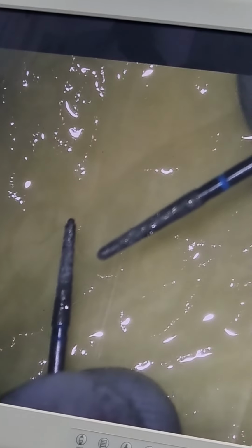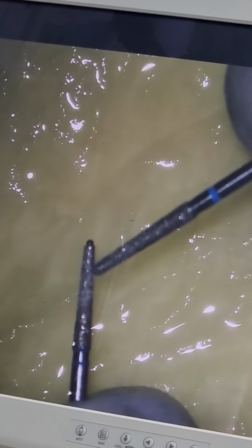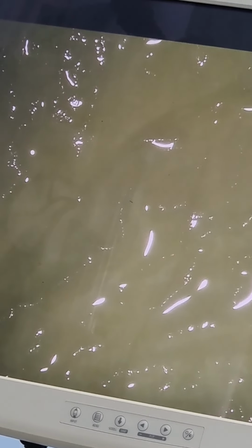Considering the size, if you use the burr on the right, obviously there will be more removal of the tooth structure. Chances of gouging or over preparation or overcutting are more. So I will use this Endo Z burr. The selection of the burr depends upon the size of the tooth. If you are working on a lateral incisor, which is very small in size, you can use a small taper fisher burr also.